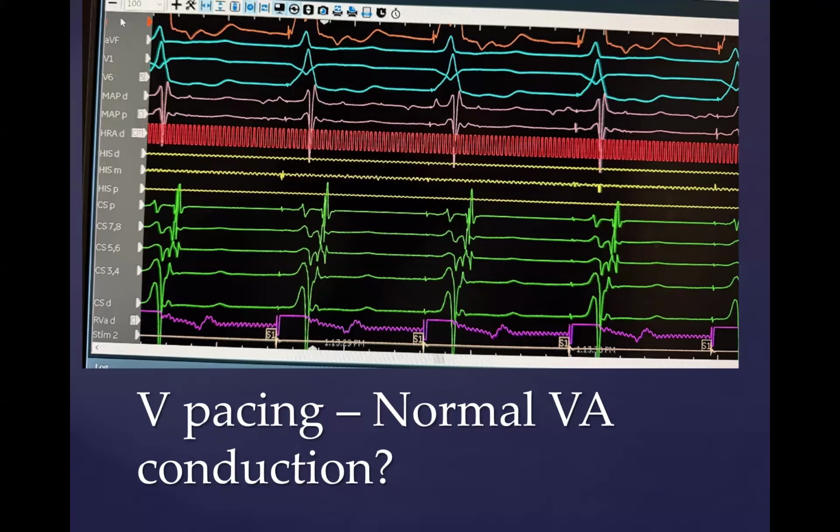Now, there are people who do left-sided pathways retrograde, where they go across the aortic valve and then retroflex the catheter back up across the annulus. They'll tell you that they're very easily able to manipulate the catheter very carefully around the annulus in a similar fashion, and the evidence suggests that that is true. But I think that in the present era, most electrophysiologists do left-sided pathways transeptally.